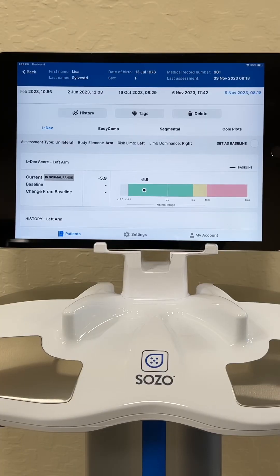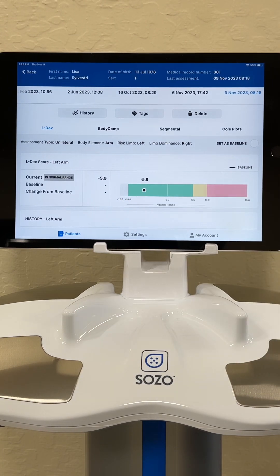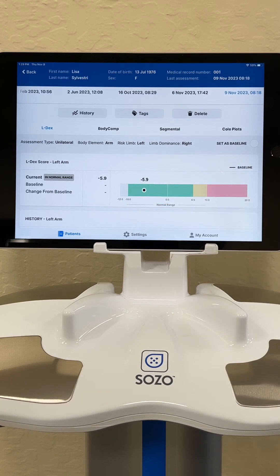Here we have my results. The first thing we look at is the LDX score, and this is the measurement of lymphedema. Green means there is no lymphedema. Yellow means the extracellular fluid and swelling levels are starting to rise, and red means there is lymphedema in the tested extremity. The black dot is today's measurement, and we can see that I do not have lymphedema.